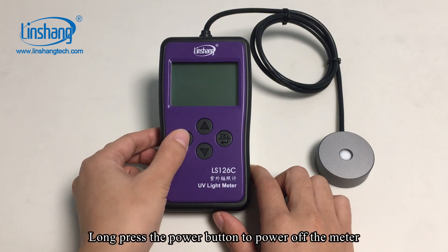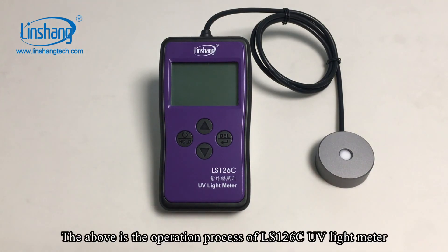Long press the power button to power off the meter. The above is the operation process of the LS126C UV light meter.